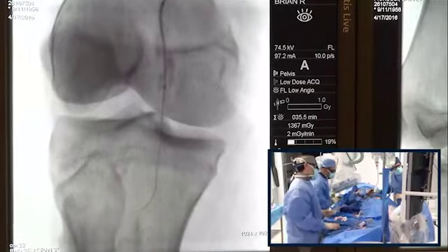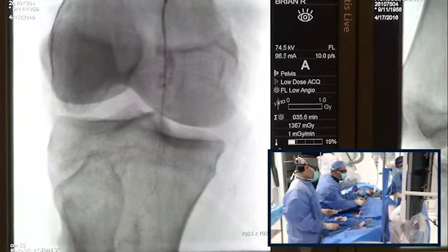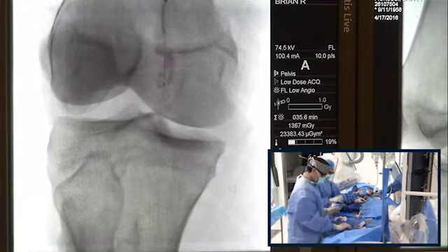What I'm going to do now, I'm going to remove the wire and take a picture. Is that okay with you, Craig? What do you guys think? Yeah, I think that's reasonable. Your wire seems nice and free, at least it seemed that way up until that movement. But I think it is free.